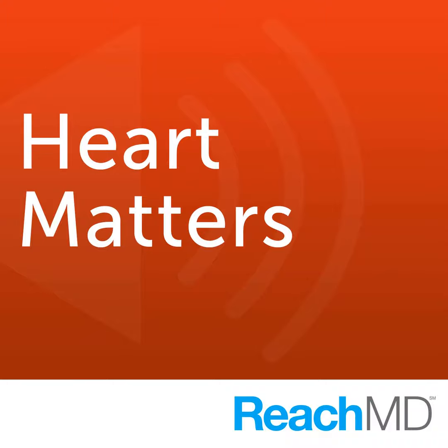Yes, I'd be happy to do that, and I think it's an important point to say that this test may have different value for different indications. And although we're talking about coronary disease in both cases, I think the clinical scenario is really quite different in the emergency department than it is in the office when someone comes in complaining of occasional limited chest pain. So if we're to take the emergency department situation first, when a patient comes in complaining of chest pain and it sounds like it may be coronary in origin, the first thing we do is get an electrocardiogram, and we also check for biomarkers like troponin levels.